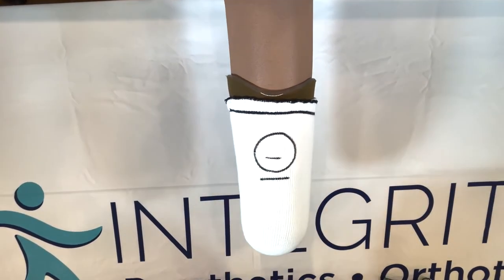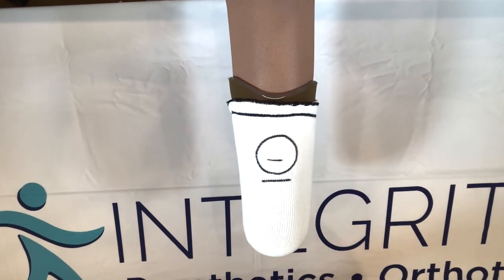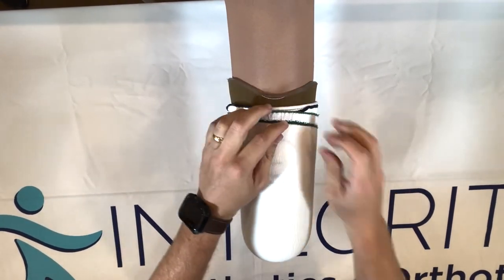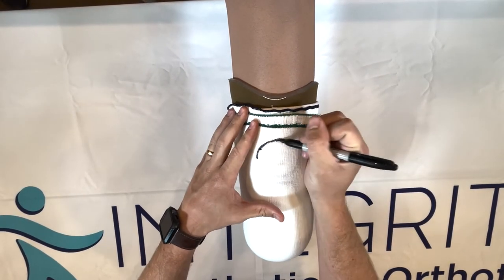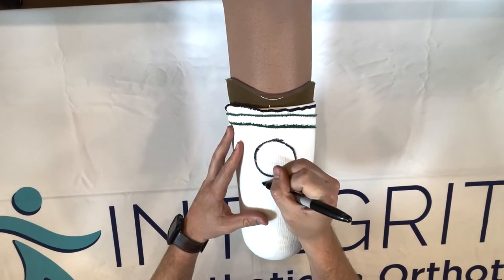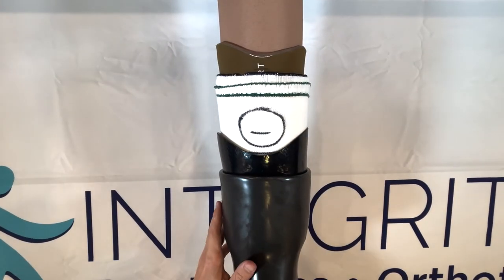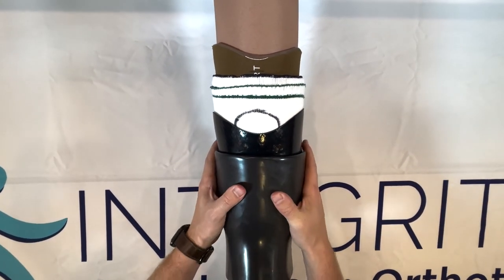So we're going to add another one — that's a three ply sock. I draw right through there again. We've got our patella, our kneecap, and again we want that trim line to finish right about there. Now with eight ply of sock on, that trim line finishes right about there — which is right where it's at. You can notice there's a lot less play in it now.